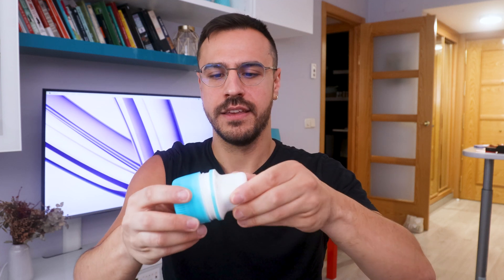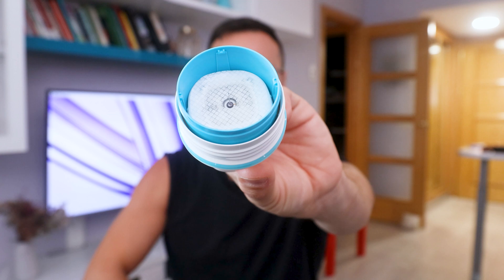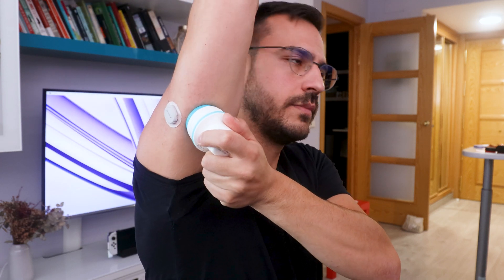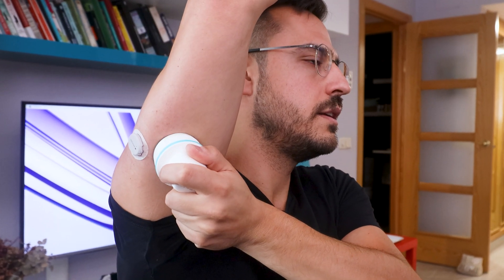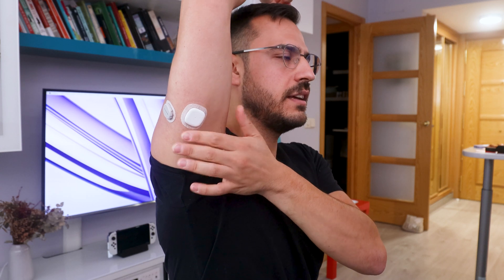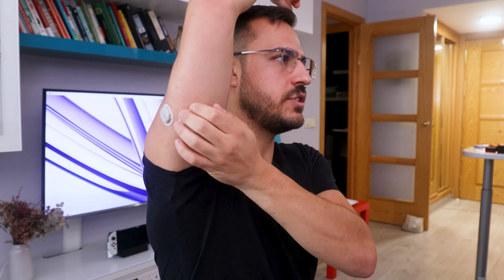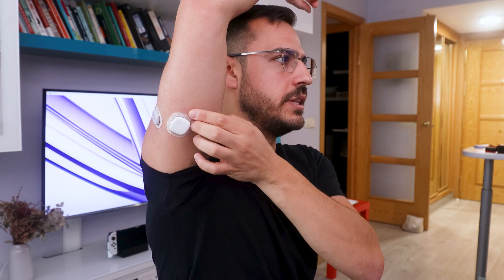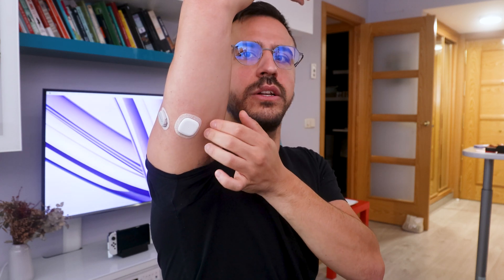When I open it up, you can actually see the needle in there. With this one there's no button — you just push it. I'll put it right here. Three, two, one. There was a teeny, teeny bit of pain maybe, but I was just scared, and I would typically not hold my arm up like this — it's just that I have another sensor on, taking the place of where I typically put these. I'm going to push this down a little bit.